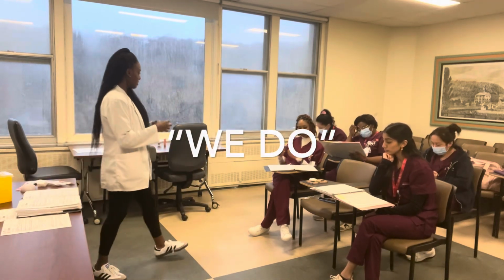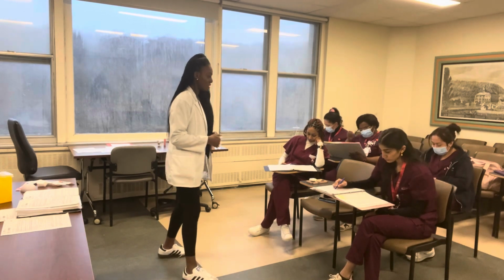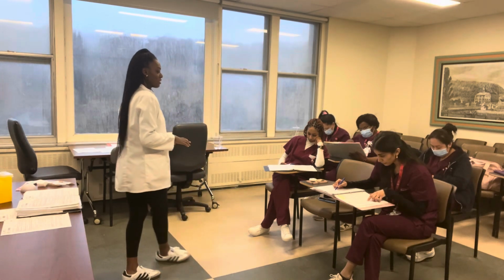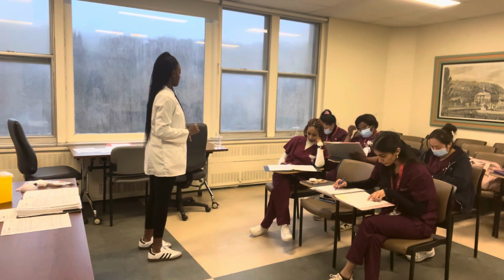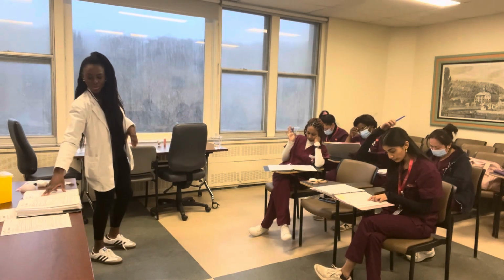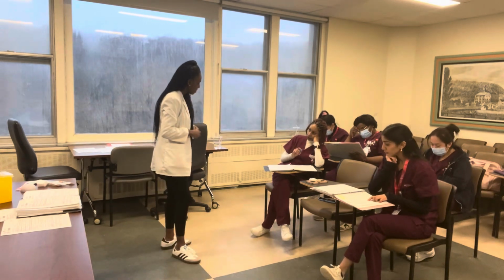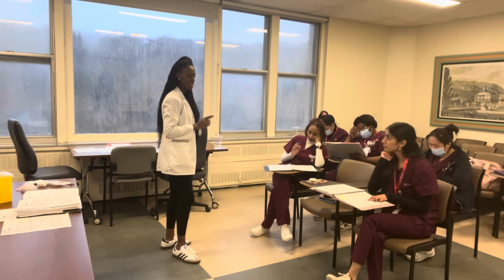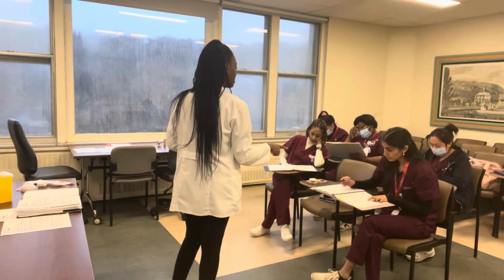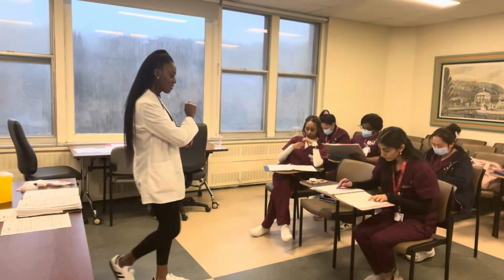So then we're going to plot that number. The number we got for the CBGM, I'm going to have you all plot it into the sliding scale, and one person raise your hand and let me know where it falls, between what and what. Still on the breakfast, right? Yeah, on the breakfast, we're on October the 4th. Okay, yes, Crystal? About 6 units. It's between what range, is what I'm asking. So 6.1 to 10. Is everybody there? Yes. Perfect. So it's between 6.1 to 10, and then what does it say to do when you take your finger all the way across?